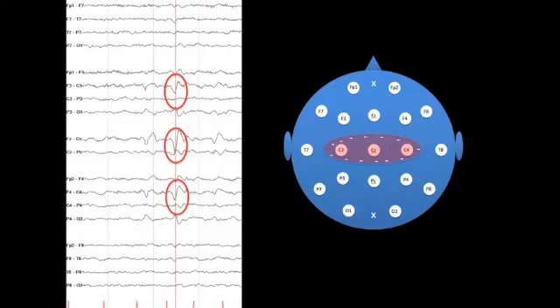Because this is a very high voltage field in a very limited area, it acts like our very tall man, changing the average of the rest of the head so that the average over the entire head is negative. Now, when we take an electrode position that is not involved in this field and compare it to the average of the rest of the head, we can say that O1 in this example is neutral, and the average, as we said before, is relatively negative for the rest of the head.